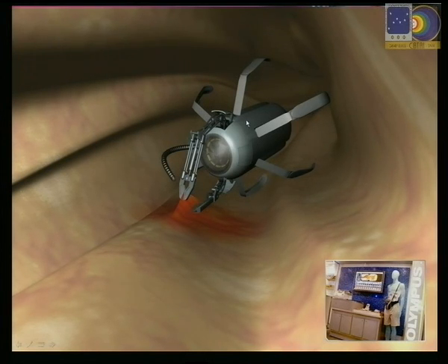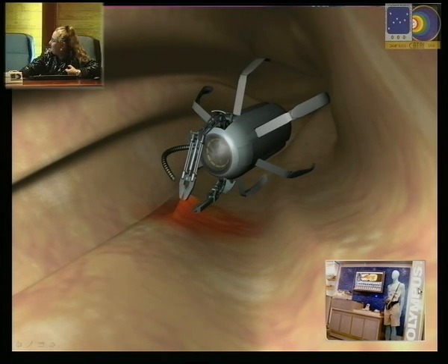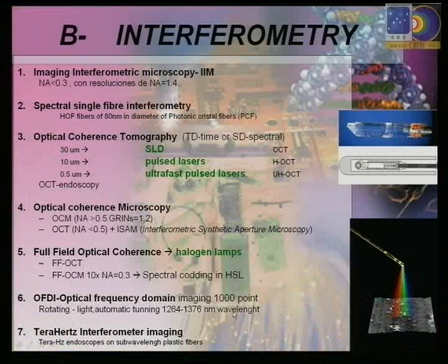The capsule is almost empty. So that means that you can put inside a lot of things. You can put treatment, you can put immunodetectors, you can put a lot of things inside of the pill in order to make the diagnosis. And the system is tracked and moved, although this is the Olympus, the previous generation, but in any case the system is tracked and moved from the outside with an electromagnetic field, and outside you can see the images directly.